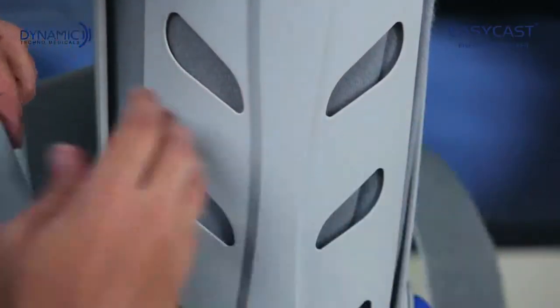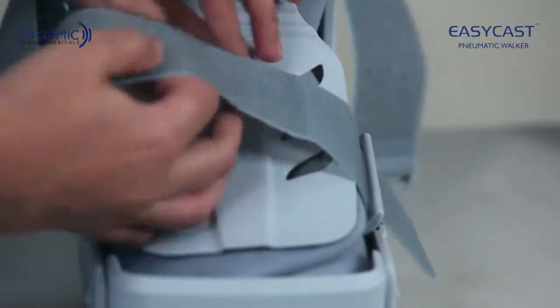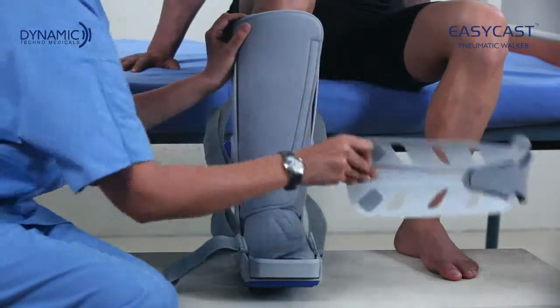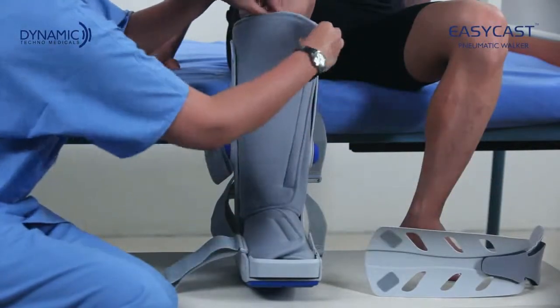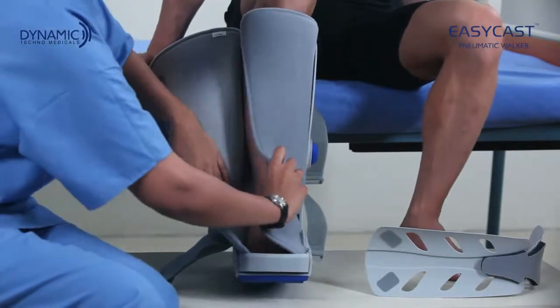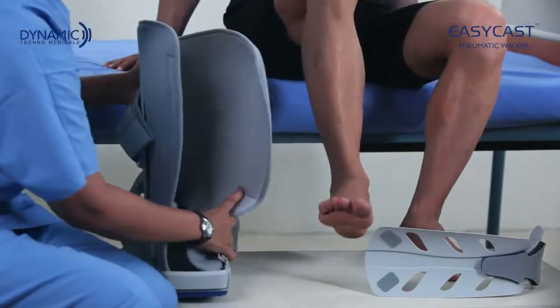Remove the front panel and open the foam liner, first around the calf and then around the foot. Take the leg out from the foam liner.